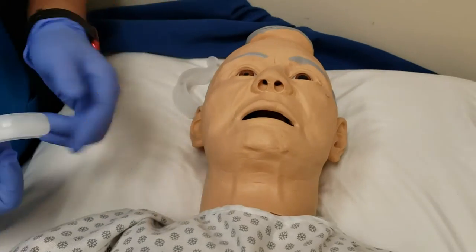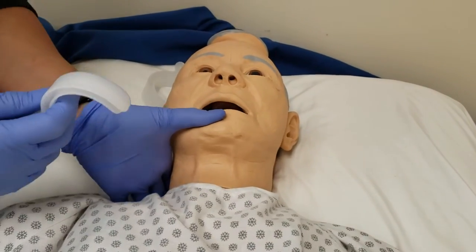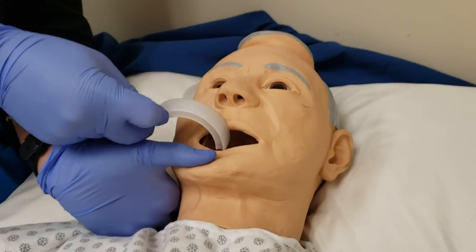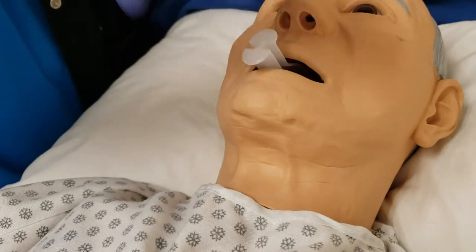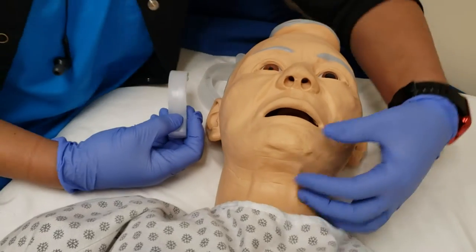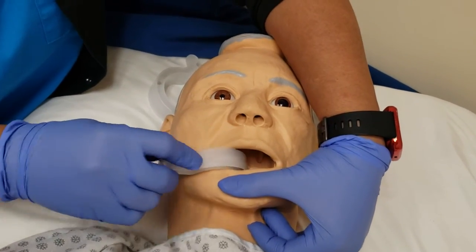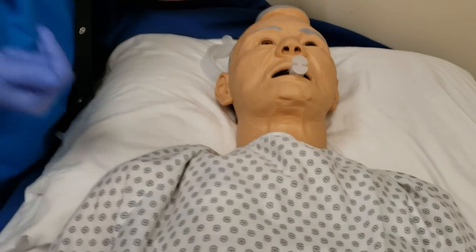Let me do that again so you can see more clearly. I'm pulling on the patient's chin here, inserting on the side, and twisting. From here, pull on the patient's chin, to the side, and twist — like that.